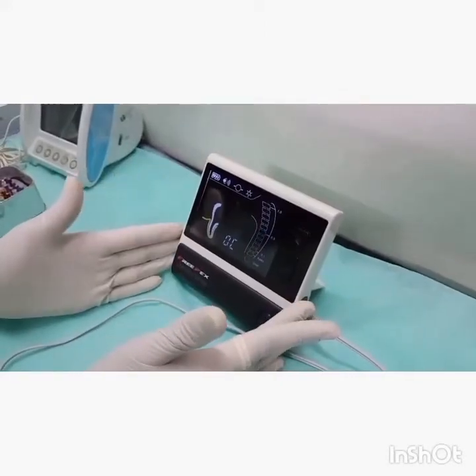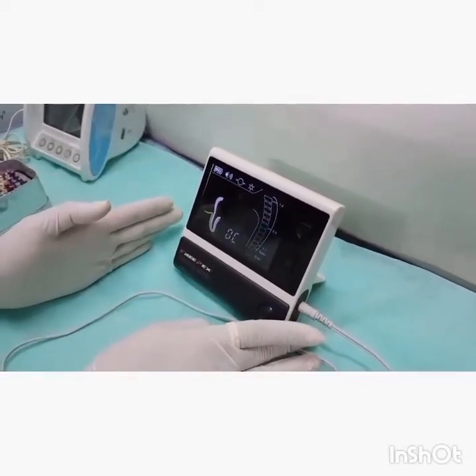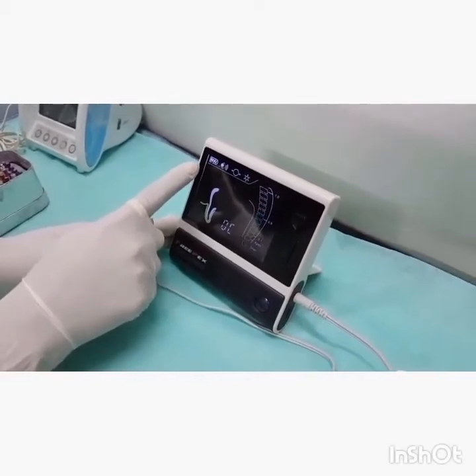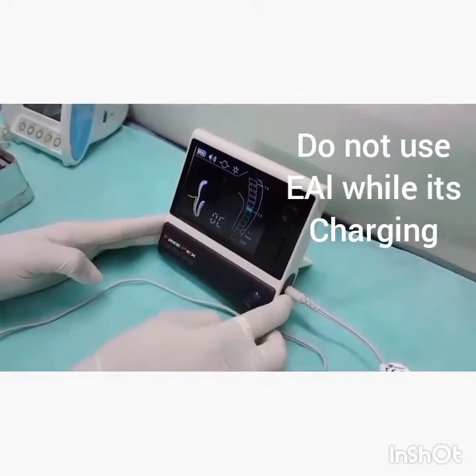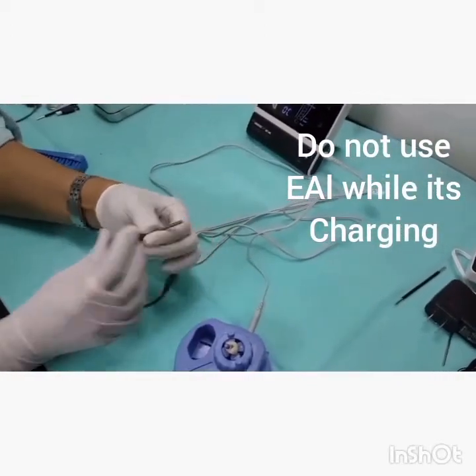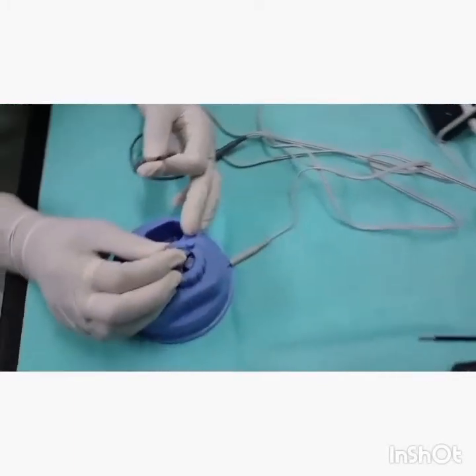I switch on my apex locator and ensure my LCD display is accurate. I make sure my battery power is more than 50 percent charged to avoid any inaccuracies in measurement. I connect my probe cord, the lip clip, and the file holder, and now I place the file inside the root canal.